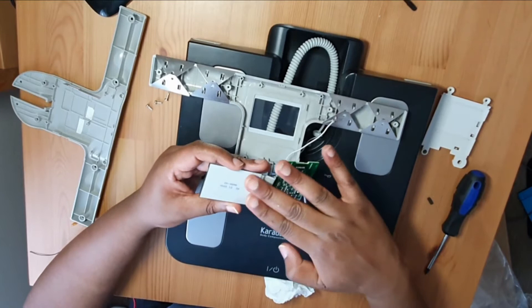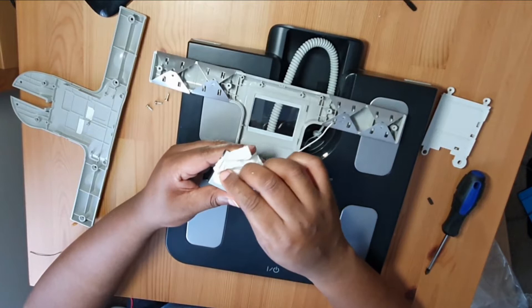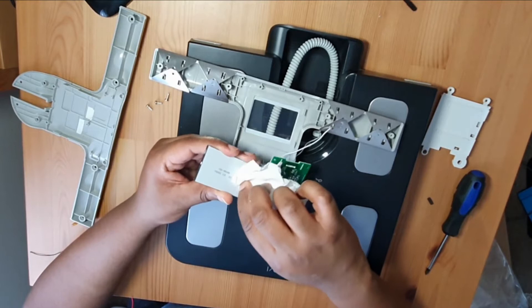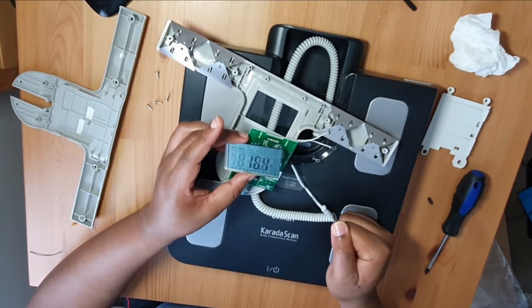The ribbon looks 100% fine to me — definitely no breaks, no kinks. I'm just going to gently press this down as well just in case it's something underneath. This ribbon runs underneath here — maybe some of the contacts have come loose. I don't want to push too hard though because it is still LCD — liquid crystal display — they can be quite delicate. Still no change.